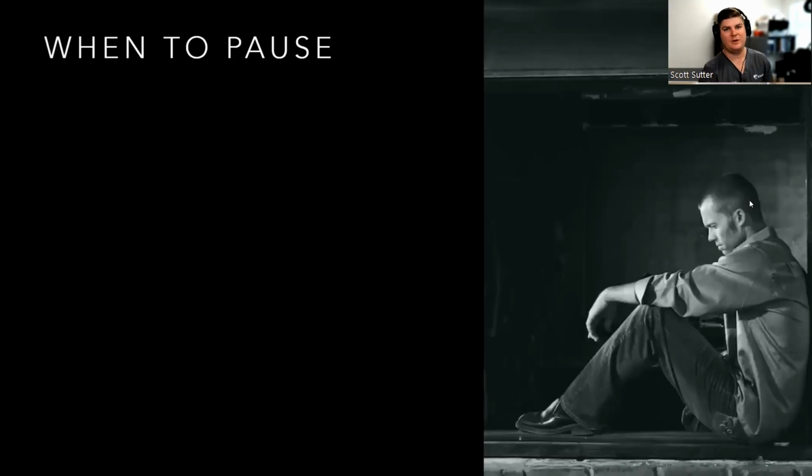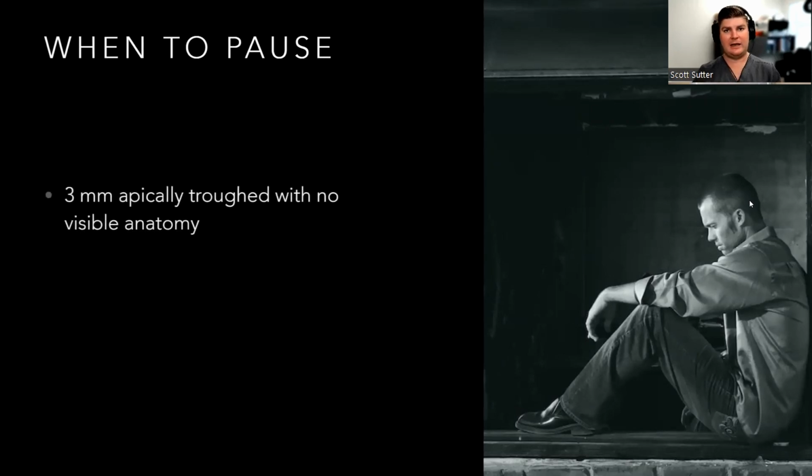Okay. When do we give up? Or in this case, when to pause. One of the beautiful things about endodontics is we do not have to do every case in a single visit. It is very easy to throw calcium hydroxide in, bring them back in a month. I tend to pause if I cannot see anything and I'm 3 millimeters down. I'm going to pause and take a cone beam and see where it is.